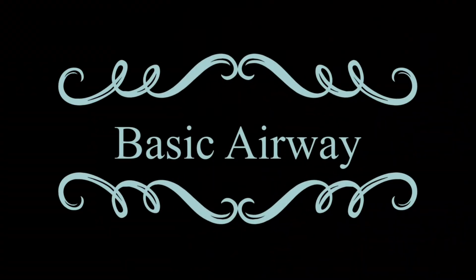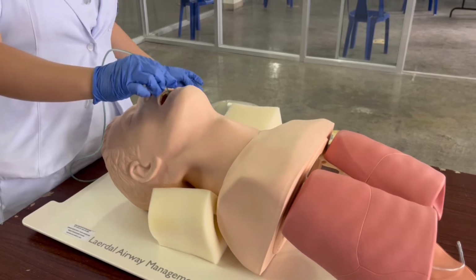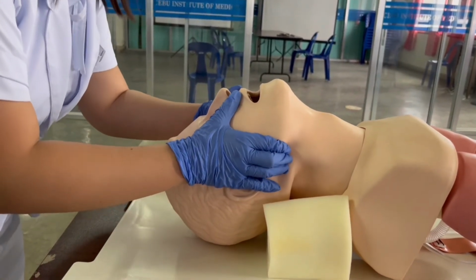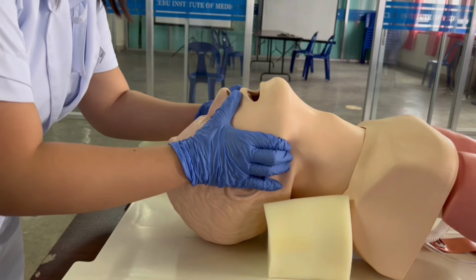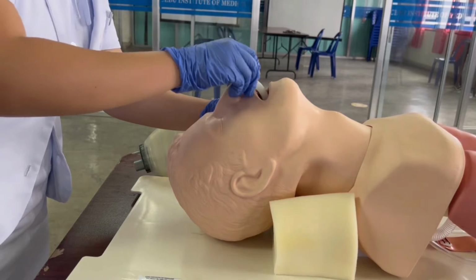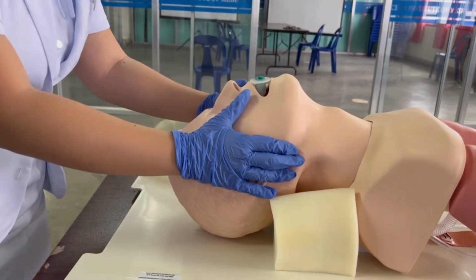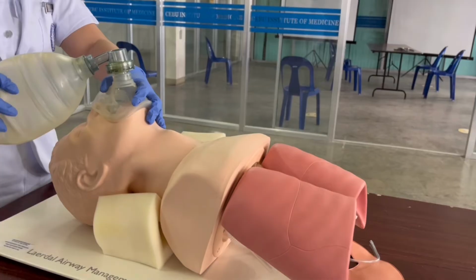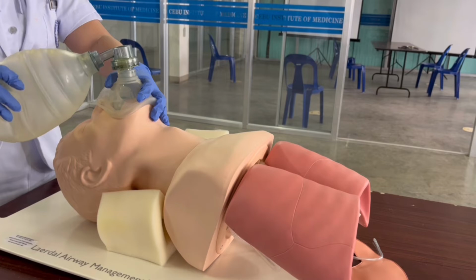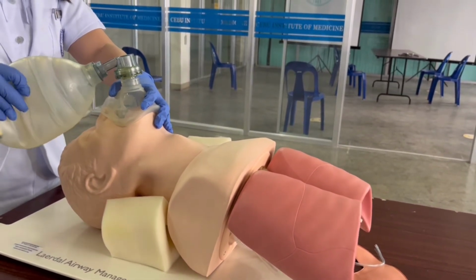Basic airway. Suction secretions that may cause airway obstruction. Then perform the jaw thrust maneuver by moving the tongue anteriorly with the mandible, minimizing the tongue's ability to obstruct the airway. To maintain the airway, an oropharyngeal airway can be inserted through the mouth or a nasopharyngeal airway through the nose. A few minutes of pre-oxygenation is started prior to intubation whenever possible. Hold the mask with good grip to ensure an airtight seal.